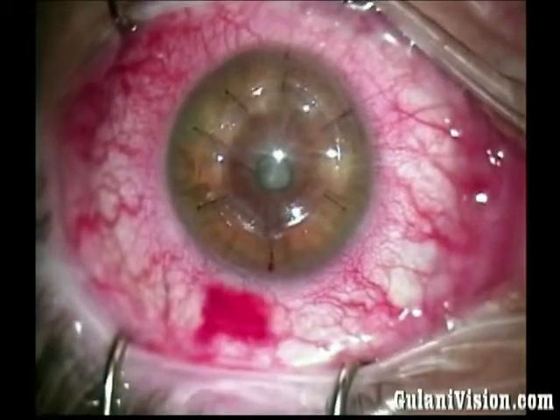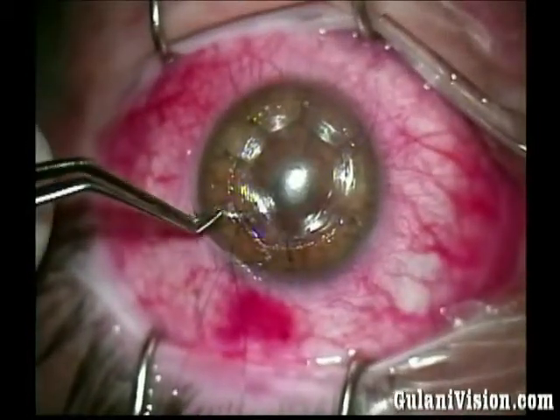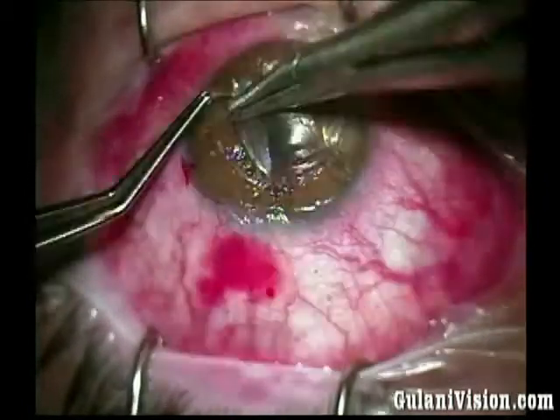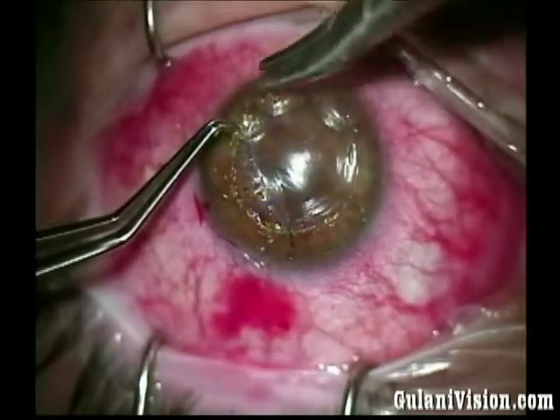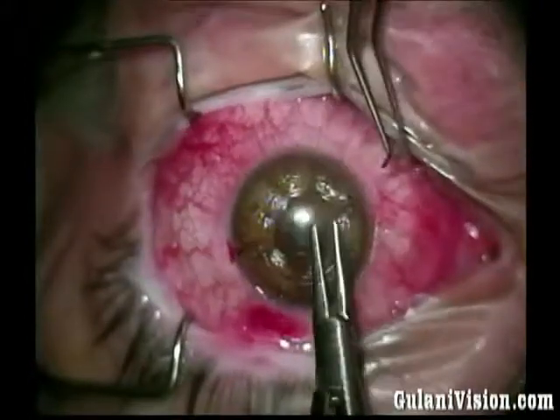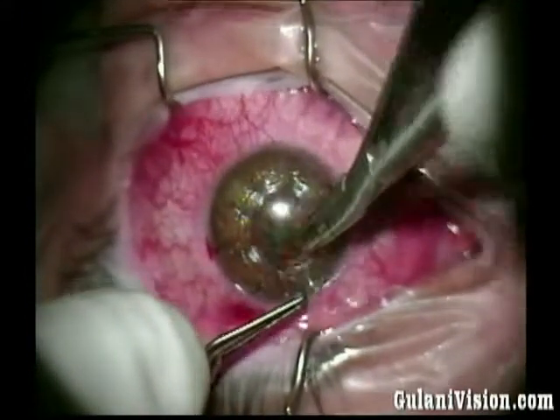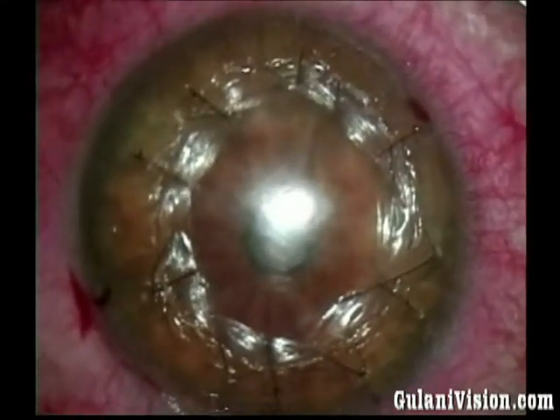I am not giving up my desire to still do my anti-torque suture, which gives me the resultant endpoint. Here we are finished with the interrupted sutures. I am now starting my anti-torque 8-bite suture — gently, one at a time, across the incisions on both ends using my instruments for counter pressure, gently buttressing the arcuate incisions in the radial pattern too. And here is the endpoint — case complete.